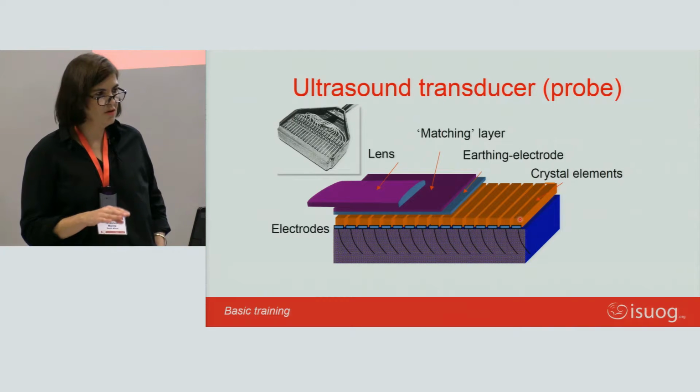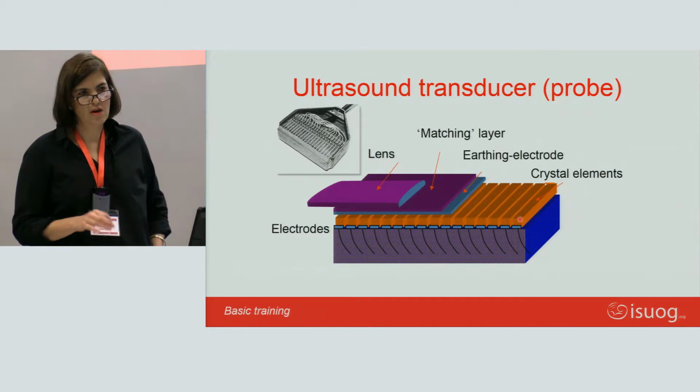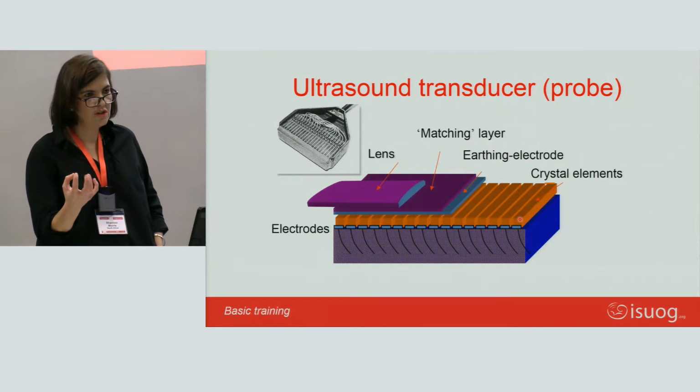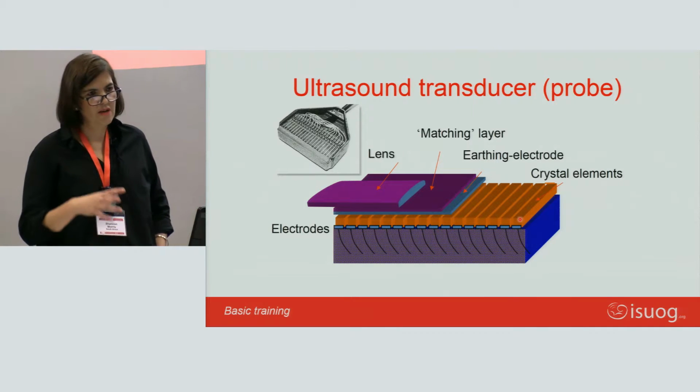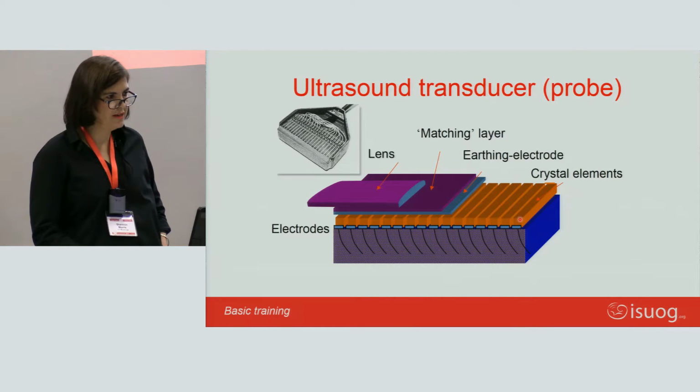There's a freeze button on your machine. When you don't push that freeze button, when you're not using that ultrasound probe, those crystals continue to vibrate. So if you finish using the ultrasound probe, put it back in its holder and push the freeze button. You will save the life of your probe.